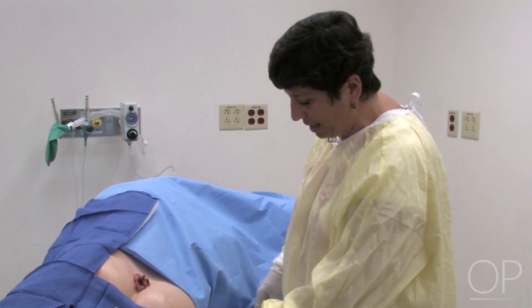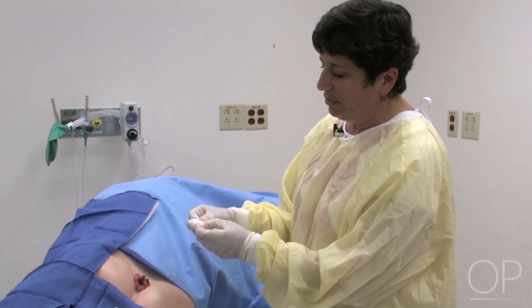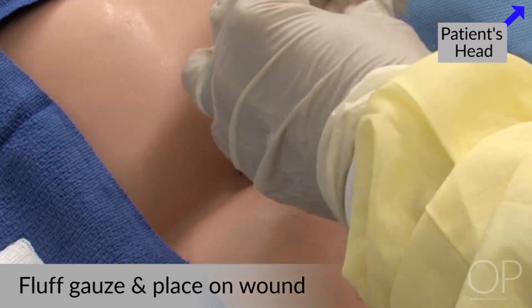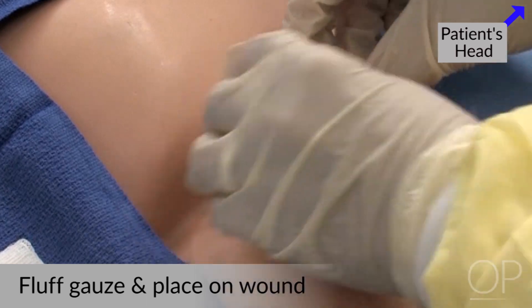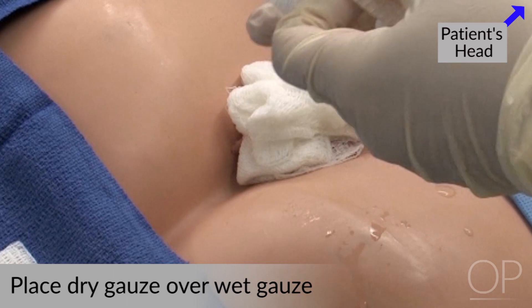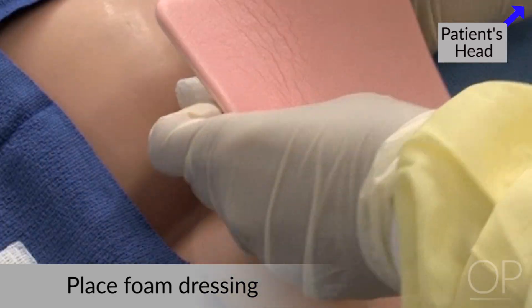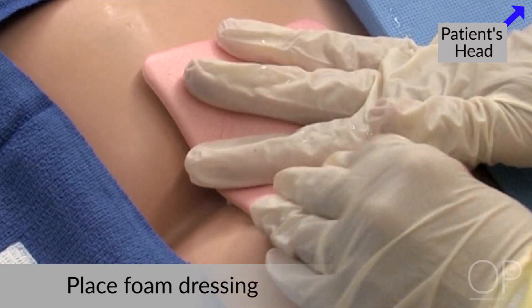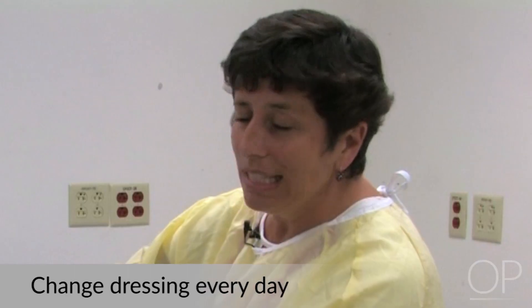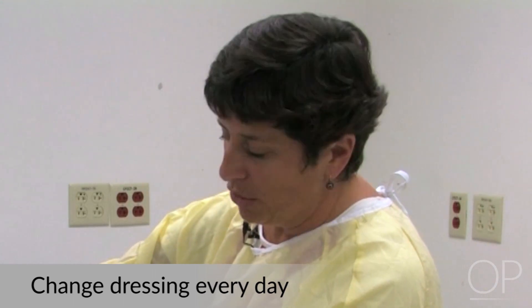Now that I've cleaned it, I'm going to take a piece of damp gauze and fluff the gauze onto the wound, then place a dry gauze over that. Then I'll put the foam dressing over for extra protection, insulation, and padding. Then I would tape the whole dressing, and I would change that dressing at least once a day, or if it became soiled with stool, or if the drainage came through to the foam dressing.